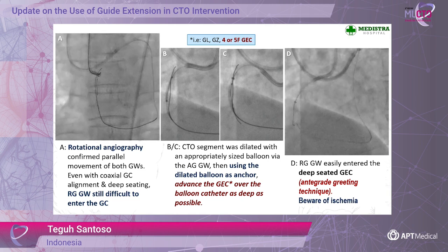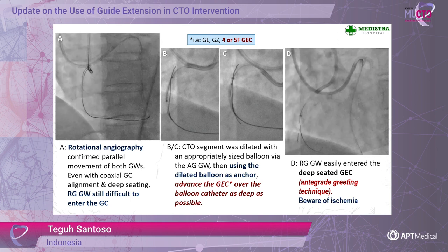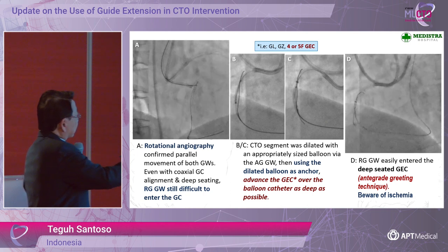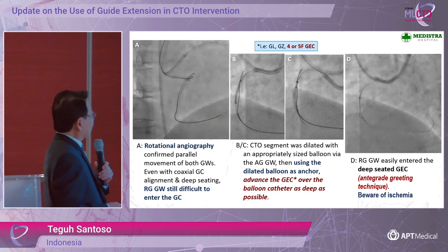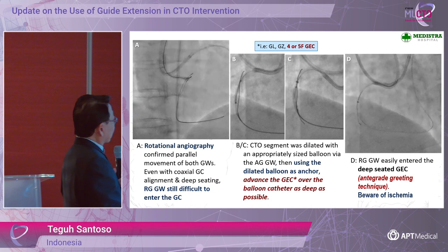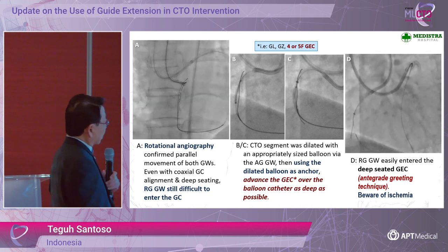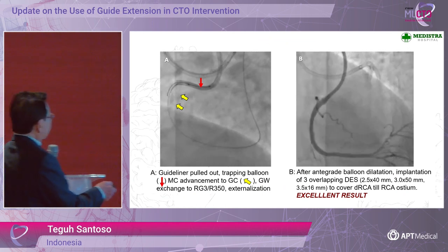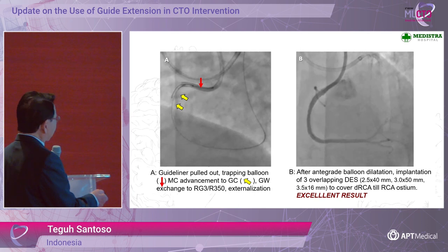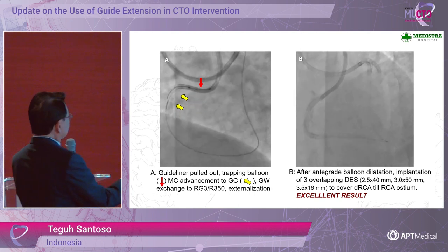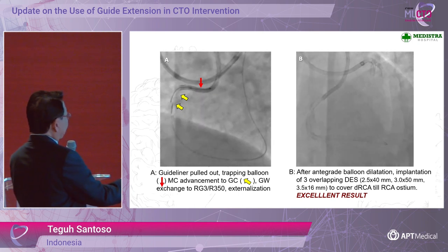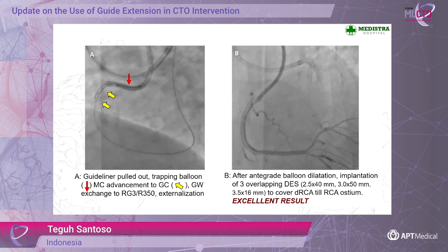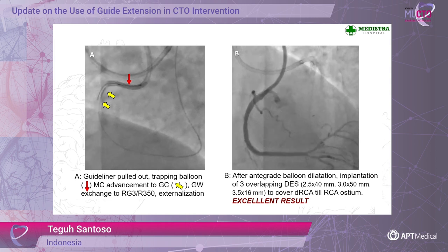We encountered difficulty advancing our wire into the guiding catheter even with coaxial guiding alignment and deep seating. So we proceeded with CTO segment dilatation using an appropriately sized balloon — this is very important. Using the dilated balloon as an anchor, we advanced the guide extension catheter over the balloon catheter as deep as possible. As long as our gear is within the vessel architecture, perforation risk is manageable. After that, the procedure was standard: we advanced the retrograde wire into the guide extension catheter, used the trapping technique, advanced the micro catheter, exchanged the wire, externalized, and completed antegrade stenting with three overlapping DES — very good result.